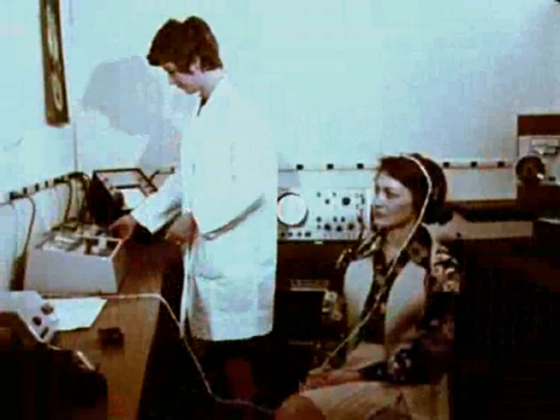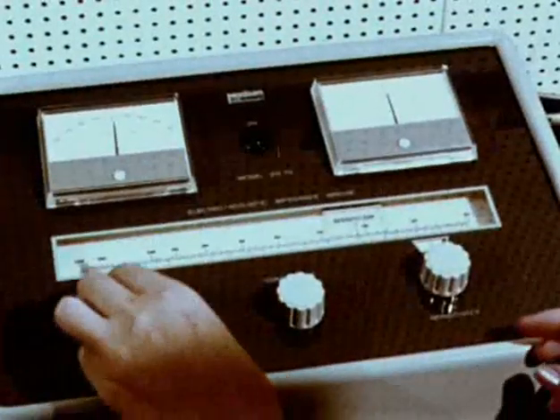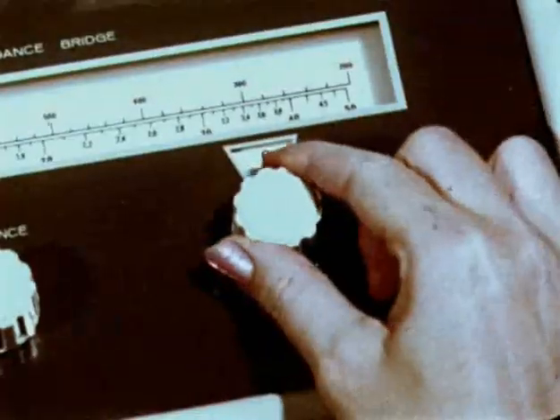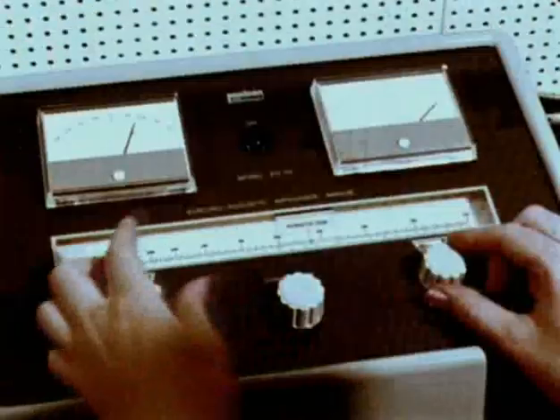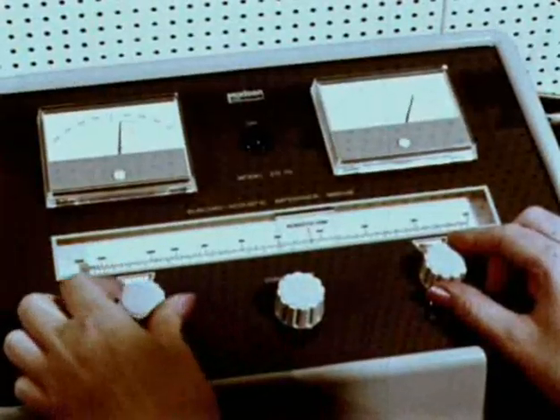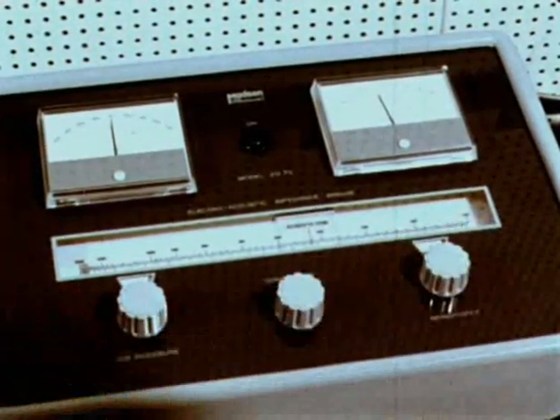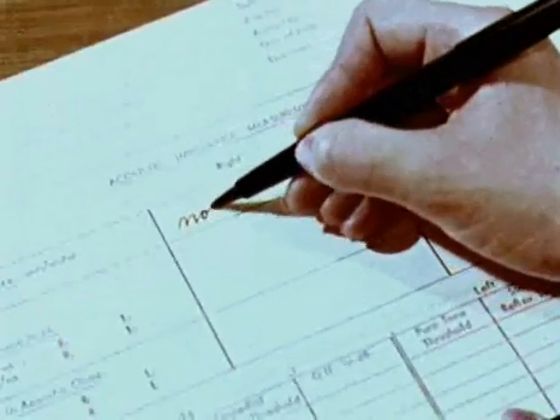Let us continue with the actual test. The pressure scale is raised to 200 millimeters of water. The machine is set at low sensitivity, scale 1, and at a high impedance. The pressure is then gradually lowered and the compliance meter observed closely. The pressure reading at the point of maximum compliance represents the middle ear pressure and is recorded.